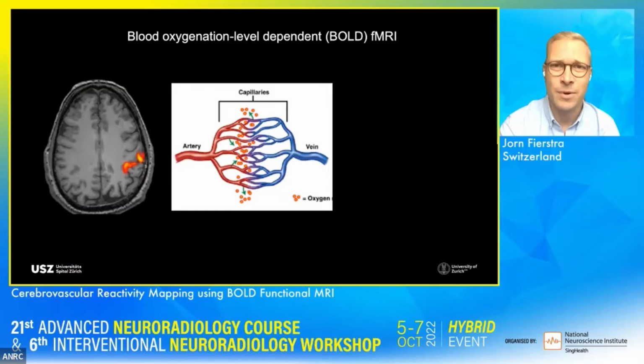have a focal increase in blood flow due to the autoregulation demand. So if you do finger tapping, you would see a very nice signal because there's increased blood flow, increased neuron activity, the neuroscientists would say, in the precentral gyrus of the hand area, so to speak.